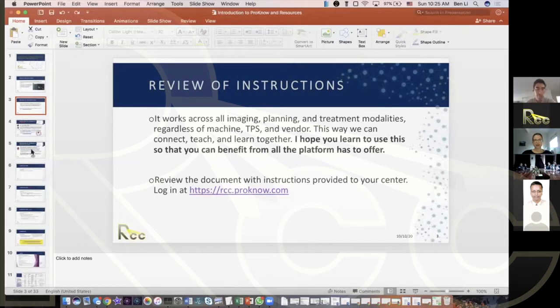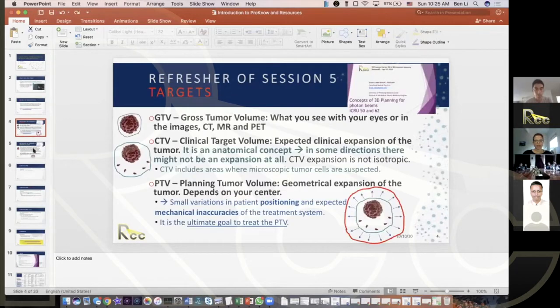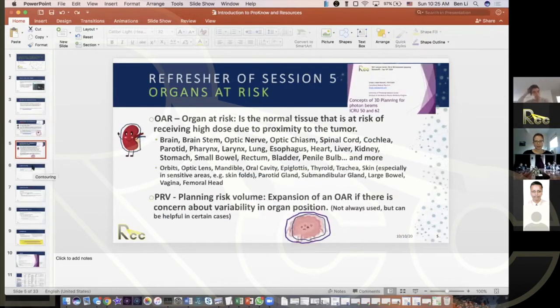Then we have a very important question, I think. So Dr. Beestoon is asking about defining the CTV from the GTV. In the case of, for example, the same disease like a rectal cancer with bulky pelvic lymph nodes, should you give the same CTV expansion to both of those sites? Or how do you as a clinician decide on how big to make the CTV expansions?